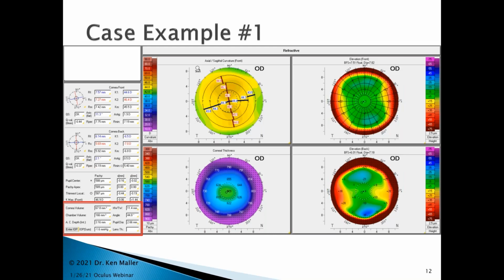The bottom there gives you cornea volume as well as the horizontal white-to-white measurement. And the pupil, this one here says it's 11.4 millimeters, and it also gives you the pupil diameter as measured at 2.66 millimeters. The upper left, that's the closest thing that would be to a Placido disc anterior surface curvature map. It's the axial sagittal curvature of the front of the cornea. And of course, you can see that this cornea has a little bit of cylinder.